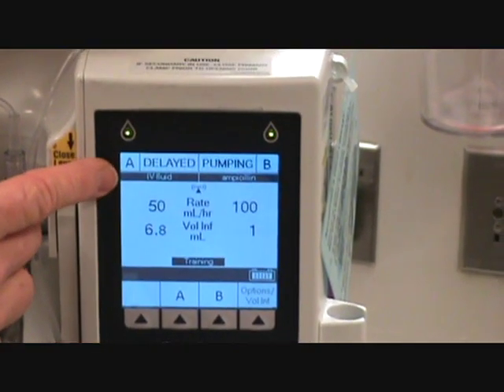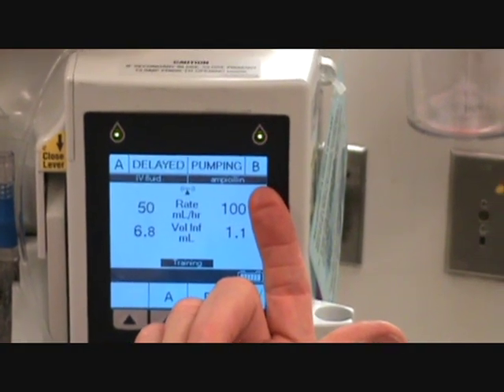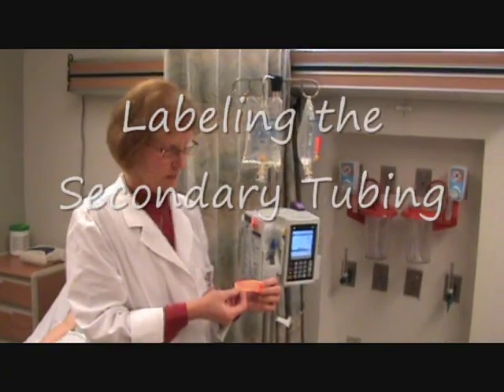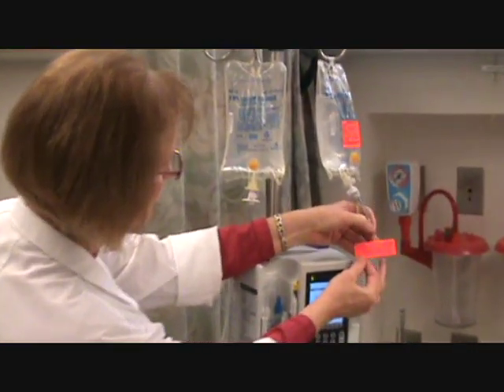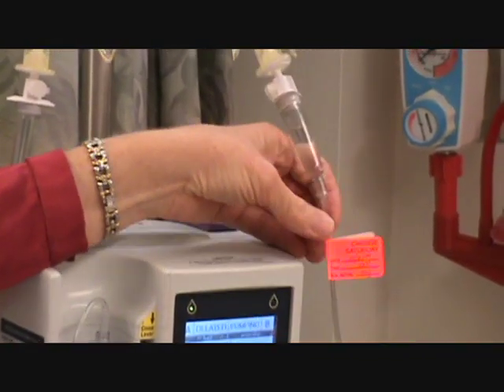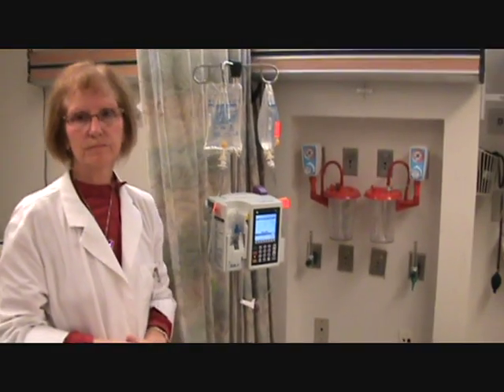You can see that the IV fluid primary line is stopped and that the ampicillin is the infusion currently running because the little light is blinking. After our piggyback is infusing, we need to put our little tag on indicating when we hung it. I hope this has been helpful to you. This is how we hang a primary infusion and a secondary infusion. Good luck.